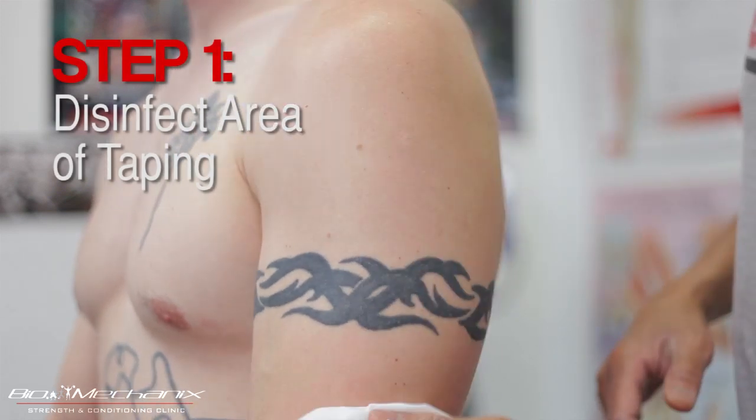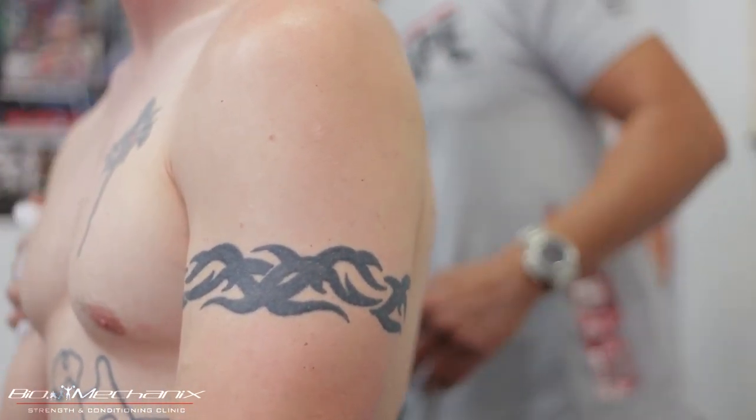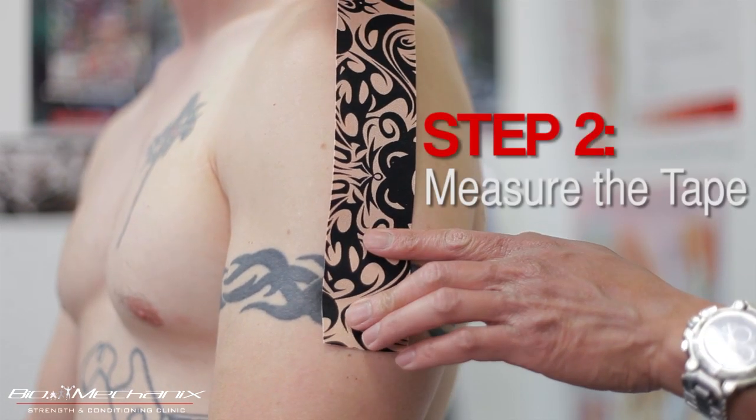Be sure to clean and disinfect the area before applying the tape. Measure the tape before applying it.